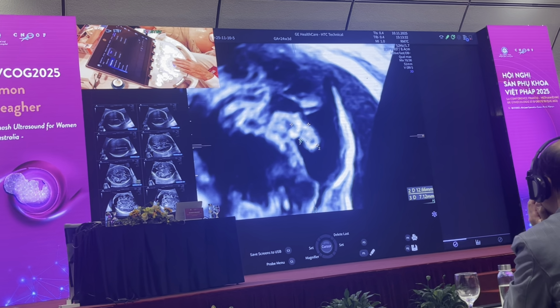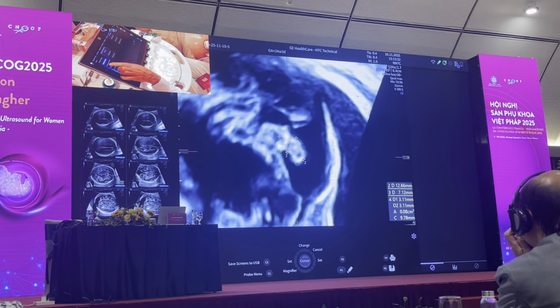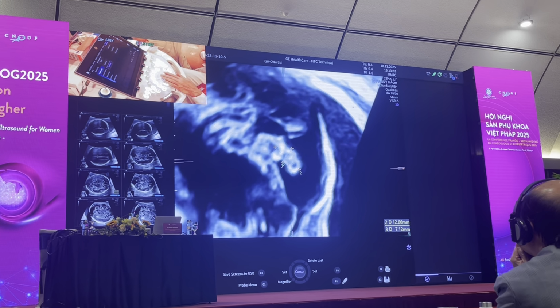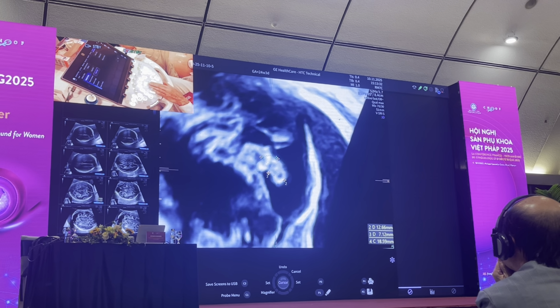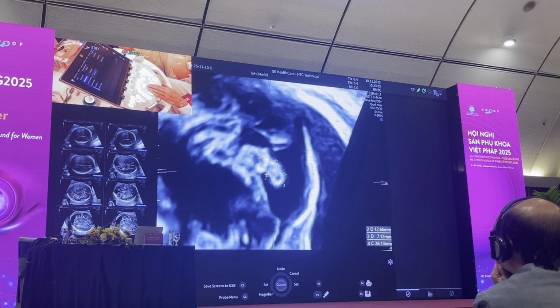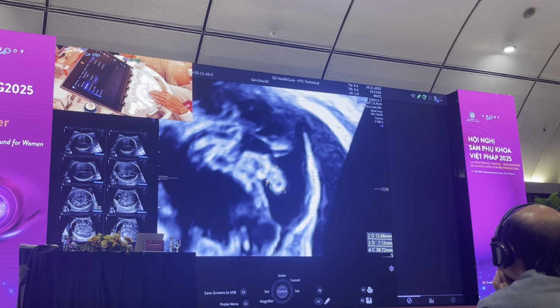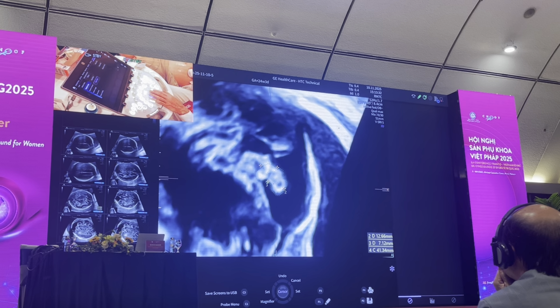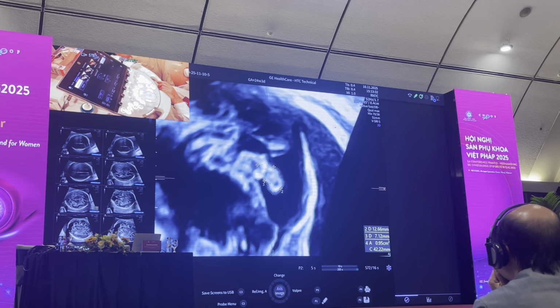This here is the fastigial point, and then I measure it from around, measure the area trace. I measure the area of the vermis. I don't carry the chart in my head, but I will need to pull out the chart and work out for 24 weeks of gestation whether the area of the vermis is okay. I then save this volume to the drive.